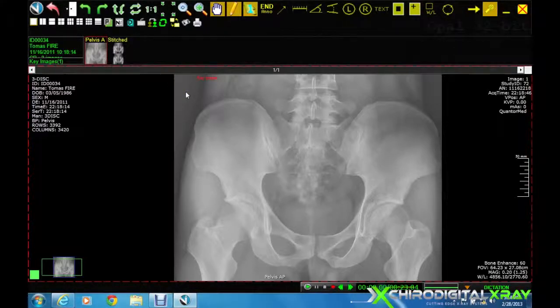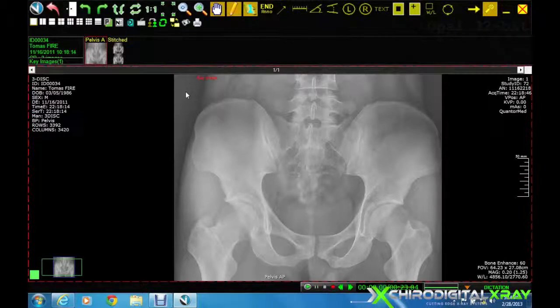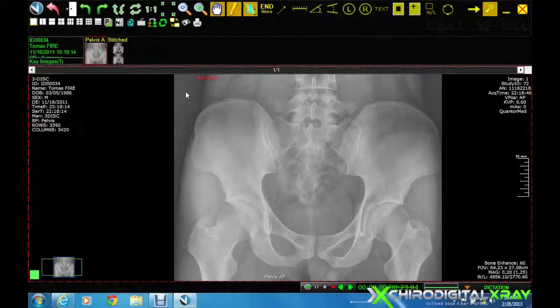The Ilium Analysis Tool is used to analyze the AP Pelvic or AP Lumbopelvic image. We'll be placing a series of 16 points on the image. It's important to remember that we must place these points in exact order, starting with the top of the left iliac crest, moving from left to right across the image, and finishing with the bottom of the right ischial tuberosity. So let's begin the analysis.